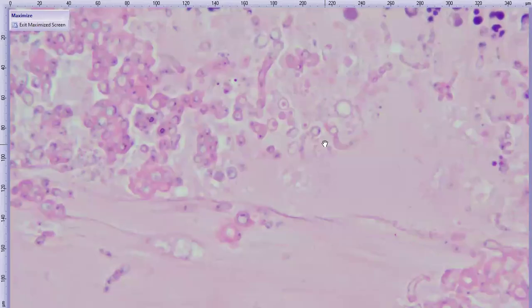I've got a few cases in rabbits that were given dexamethasone. In their eyes? Widely disseminated. It's not limited to any tissue, it's everywhere. Yeah, in the glomerular capillaries and stuff. Oh, renal thrush. Renal thrush. Candidemia, renal thrush, really fun words. So to repeat, David Gasper was saying that he's seen disseminated candidiasis in rabbits administered dexamethasone.